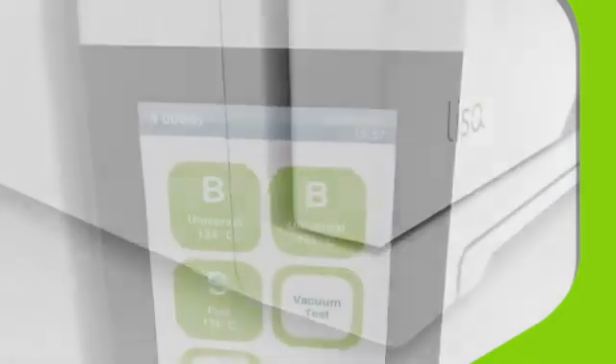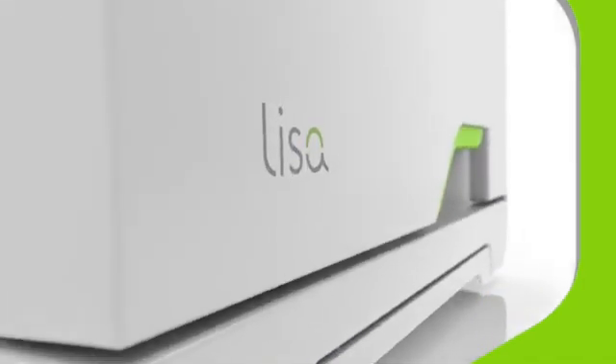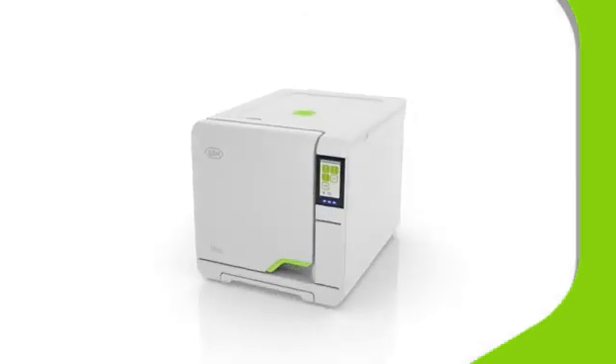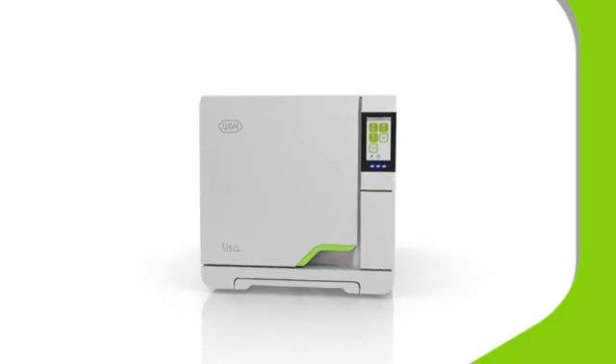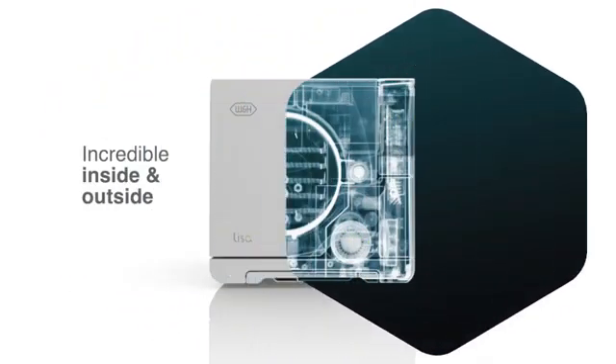Now you have met the new Lisa VA-131 vacuum sterilizer. We think you'll agree that it is outstanding in all the categories that matter. For a type B vacuum sterilizer that processes to the highest standards of safety and hygiene in modern dental practice, look no further. Lisa. Incredible. Inside and out.